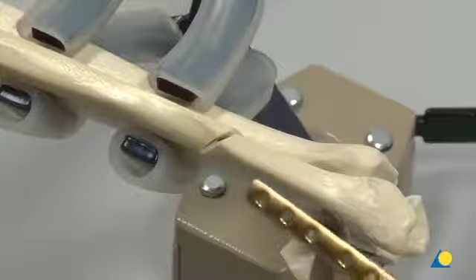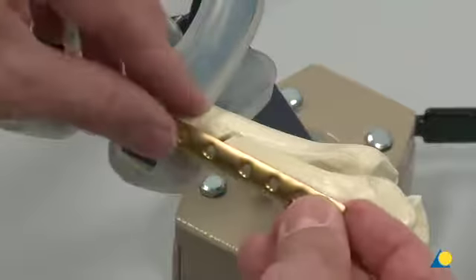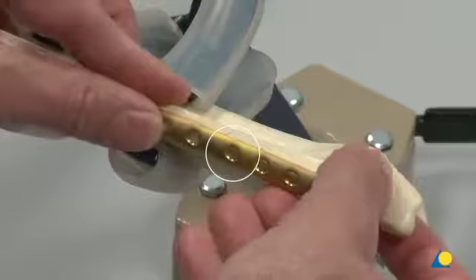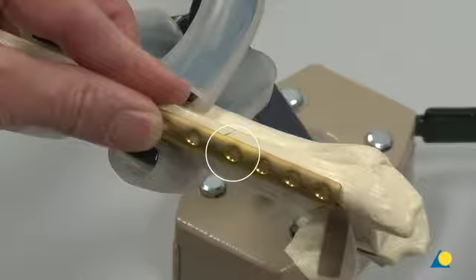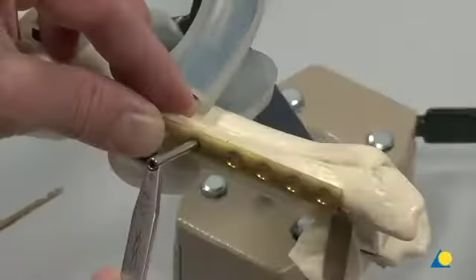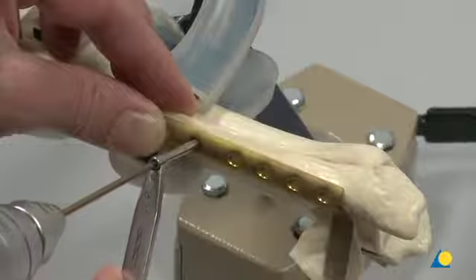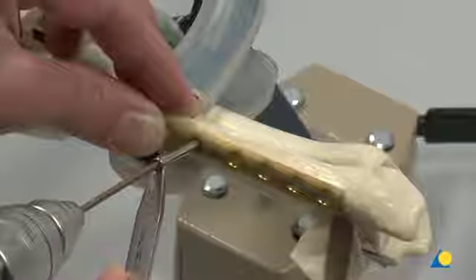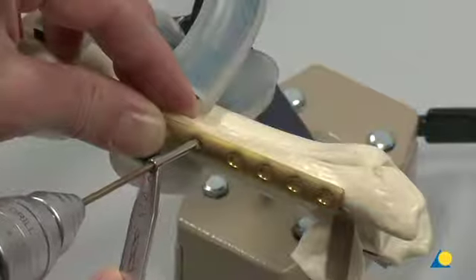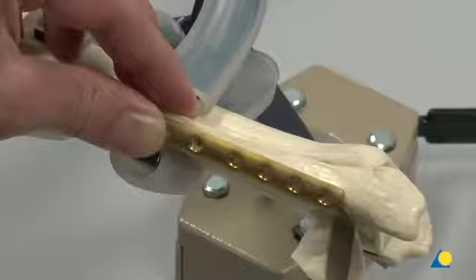The 7-hole LCP 1/3 tubular plate is placed onto the bone with the middle hole distal to the fracture. This hole will be used for the lag screw. Contouring is not necessary. A neutral hole is drilled through the third proximal plate hole close to the fracture using the 2.5 mm drill bit and 2.5 3.5 universal drill guide.